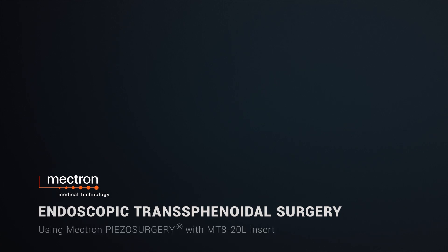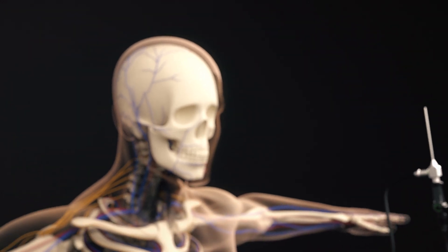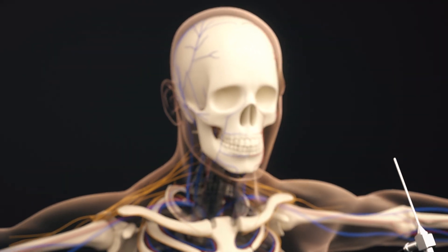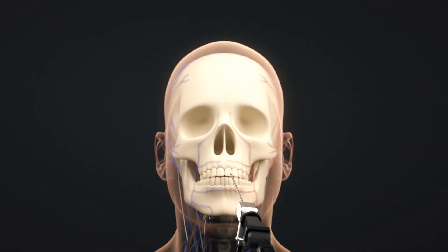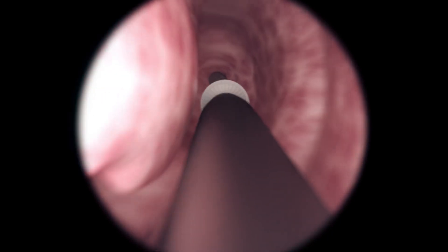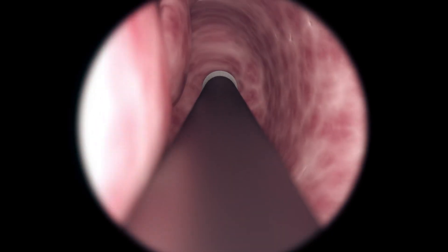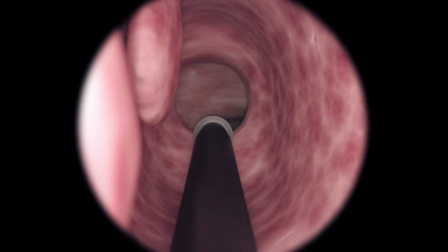The endoscopic transnasal transsphenoidal approach provides a unique access to the skull base, looking into the patient's right nasal cavity. With a zero-degree endoscope, the natural ostium of the sphenoid sinus is identified and expanded with a circular punch.